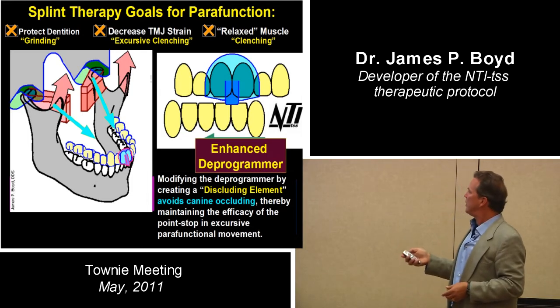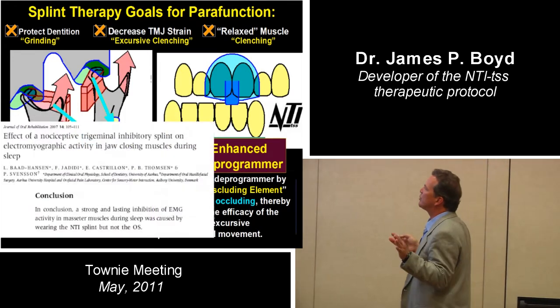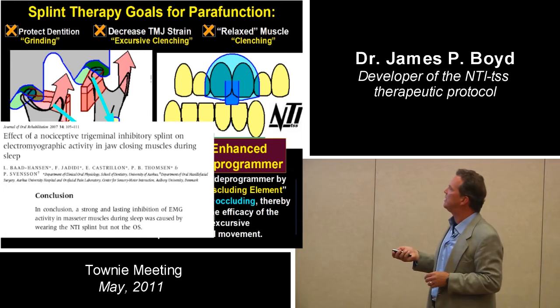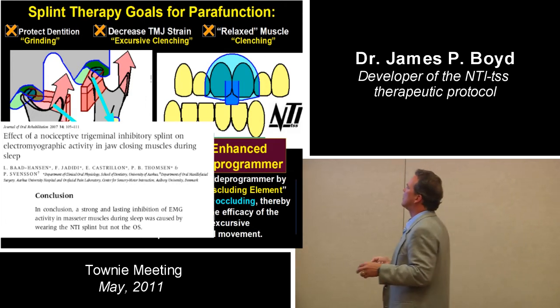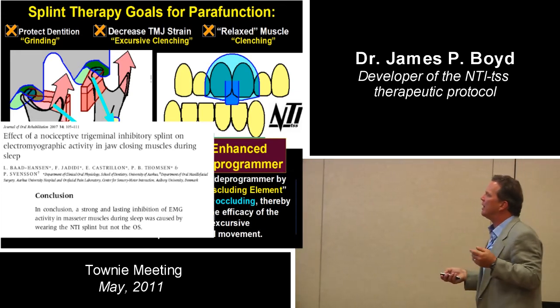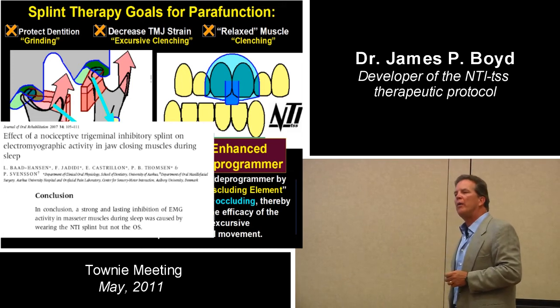So once you've removed that, oh, by the way, the effect of an NTI inhibitory splint on EMG activity of jaw closing muscles during sleep. The conclusion is a strong and long-lasting inhibition of EMG activity in masseter muscles during sleep was caused by wearing the NTI splint but not the occlusal splint. Isn't it weird? A strong and long-lasting inhibition. Why would they phrase it that way? Why would we talk about a long-lasting inhibition?